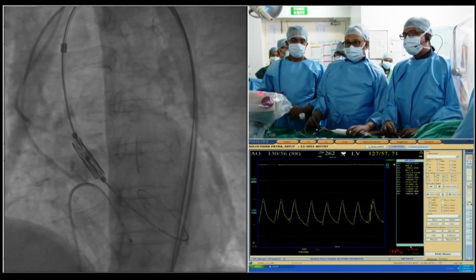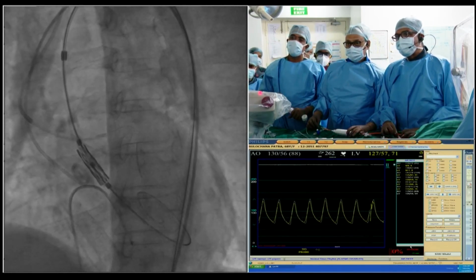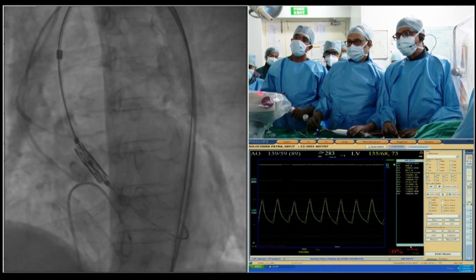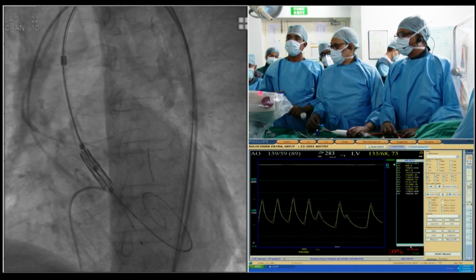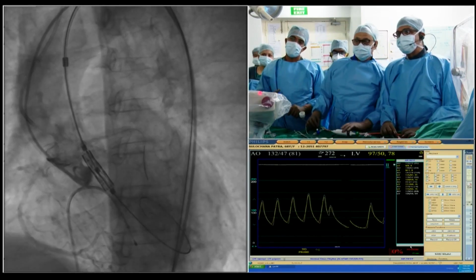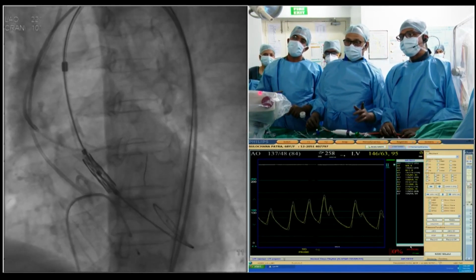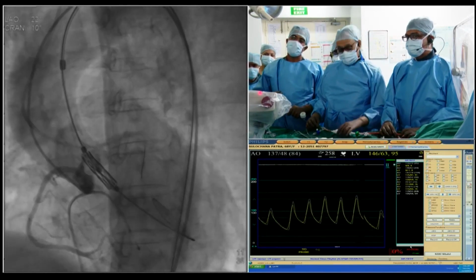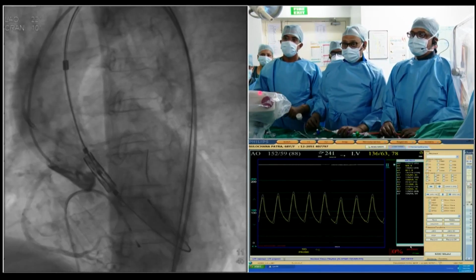Yeah. That looks good. A little bit deep, maybe. A little bit deeper. We want to be a little bit deeper. That is what Manoj is telling me, okay. I agree with that. And so let's go ahead and take a picture, please. Okay, inject. Maybe up, no? Yeah. I think that's good positioning because we want to make sure the left doesn't get obstructed. Okay. So, yeah. Are you happy with that, Anil? Do you think it's a little too deep?